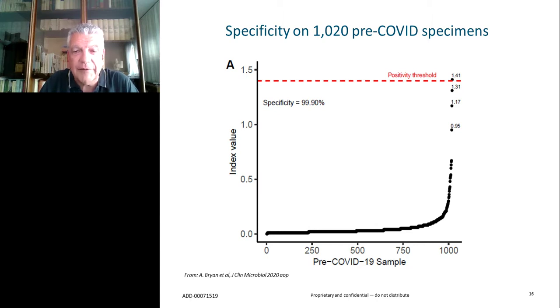The other valuable information we get out of that is the distribution of the negative results. As you know, an assay may be more or less robust depending on how the results are distributed, and the more the negatives are far away from the threshold area, the better it is, because it will guarantee against shifts in specificity according to external variables.